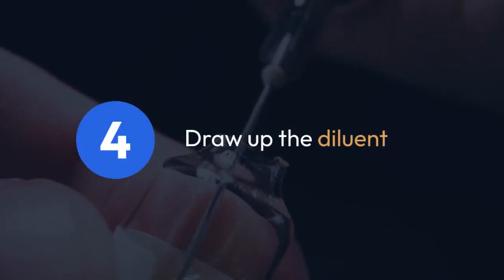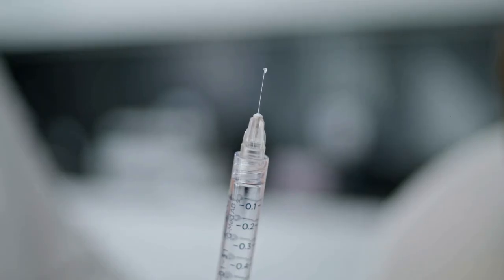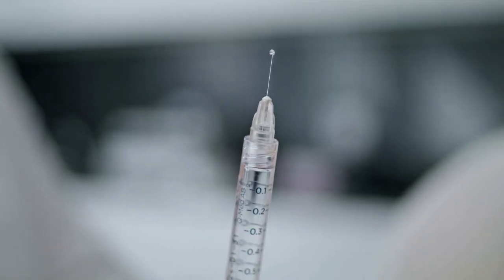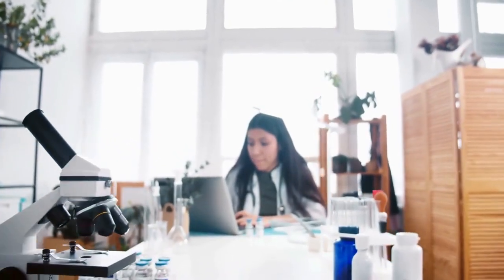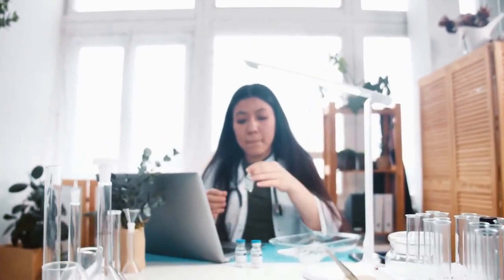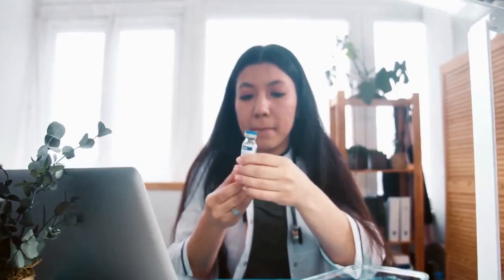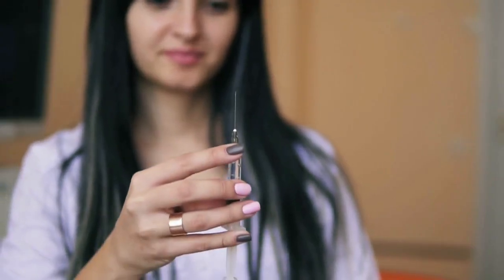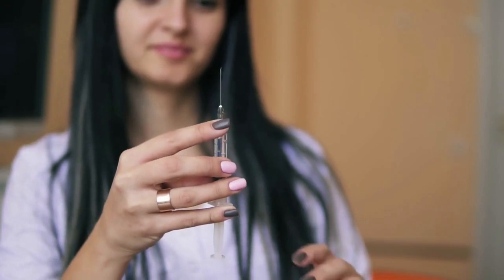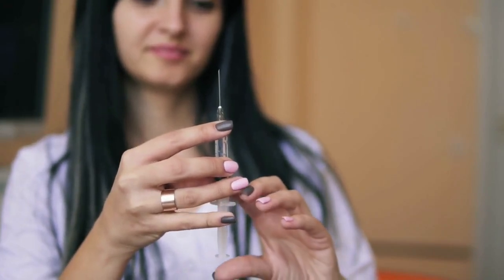Step 4: Draw up the diluent. Using a sterile syringe, draw up the required amount of diluent as specified on the artesanate vial label. This amount will vary depending on the concentration of the artesanate. Double-check the volume to ensure accuracy. Step 5: Add the diluent to the artesanate vial. Insert the needle into the rubber stopper of the artesanate vial and slowly inject the diluent into the vial.